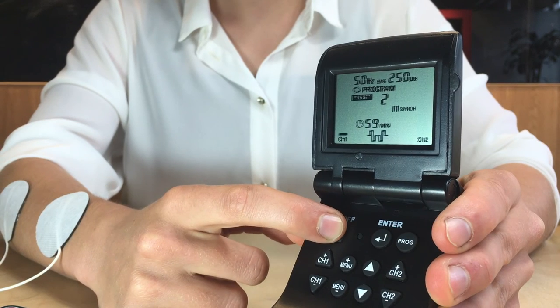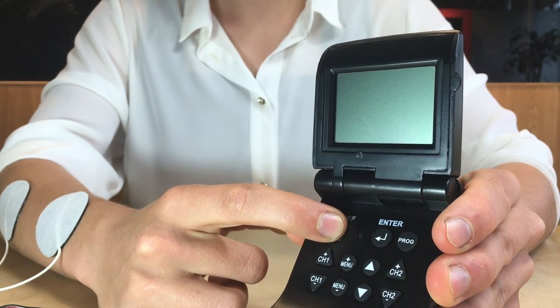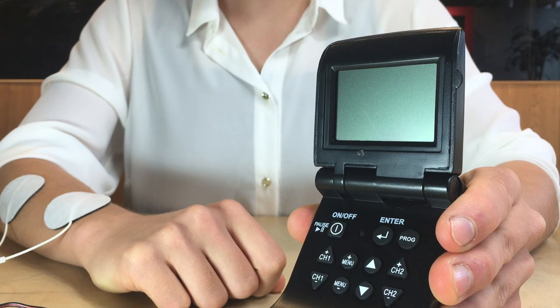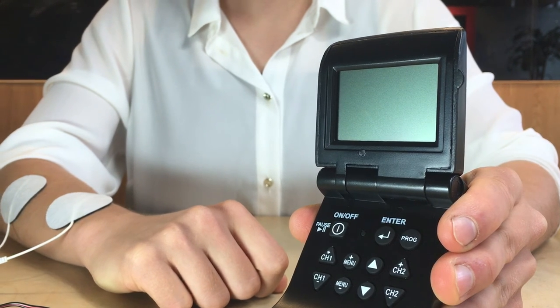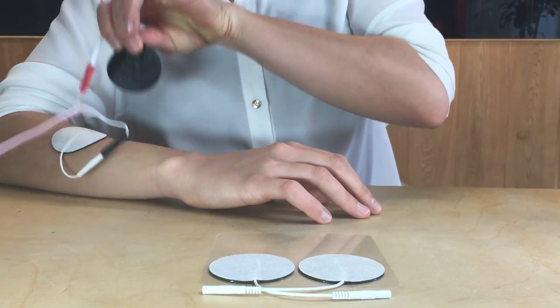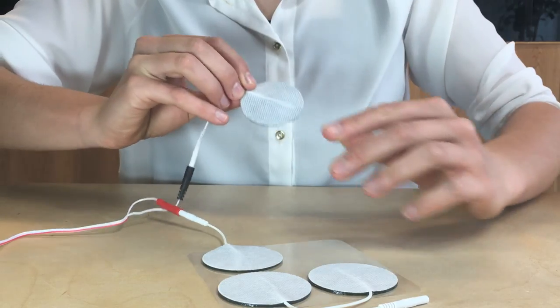After treatment, if your device is still on, you can turn it off by pressing and holding the Power button — you will know it is off when the screen is blank. It is then important to place the electrodes back onto the plastic sheet and seal them in the Ziploc bag to preserve their gel for later use.